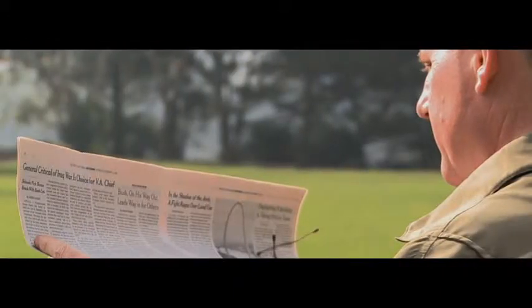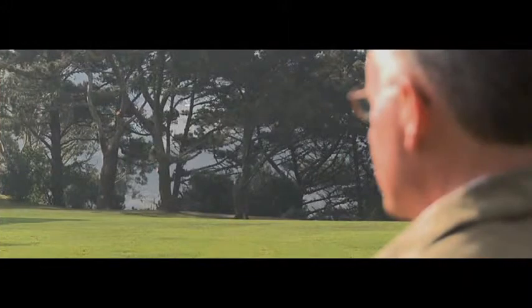If you choose to have a monofocal IOL set for near vision, allowing you to read without eyeglasses, then you will need glasses to see clearly in the distance. If you want the convenience of being less dependent on glasses for both near and distance vision after cataract surgery, a newer generation of IOLs can help you achieve this.